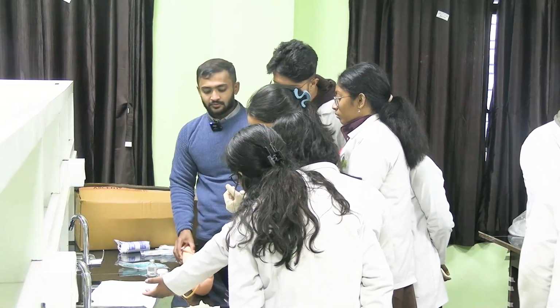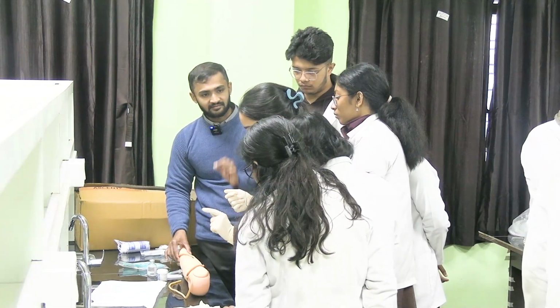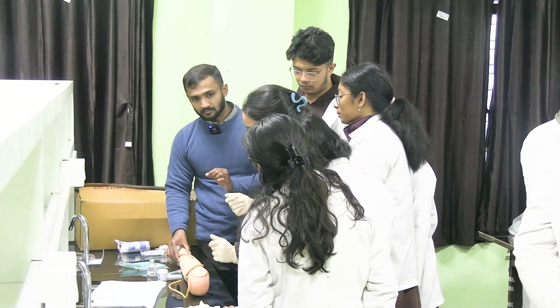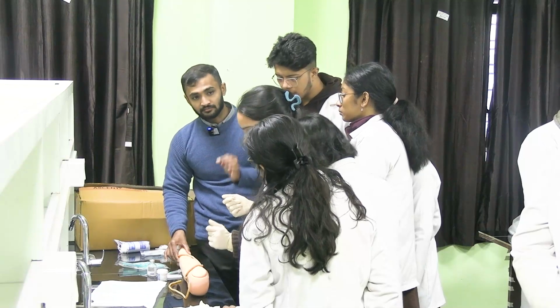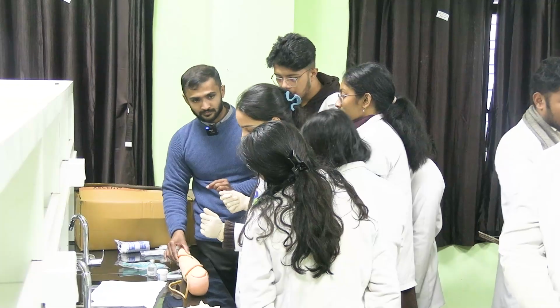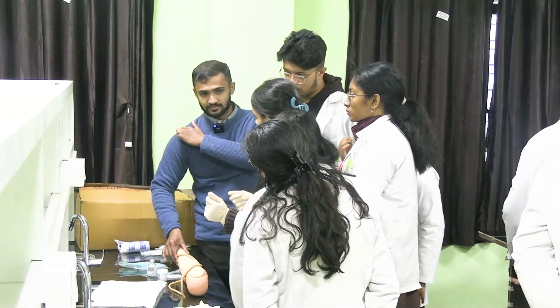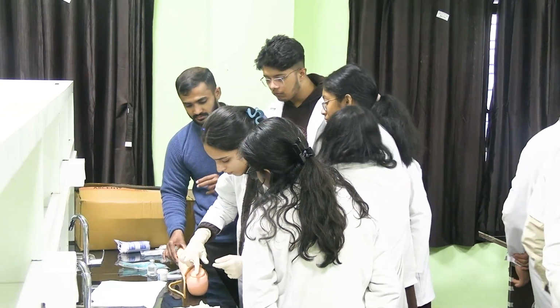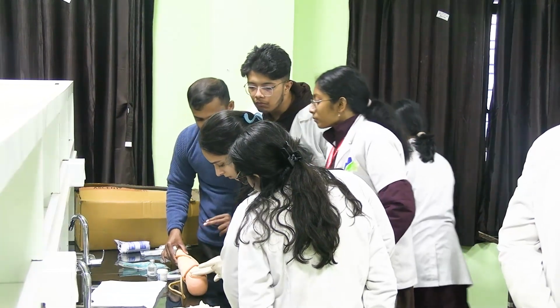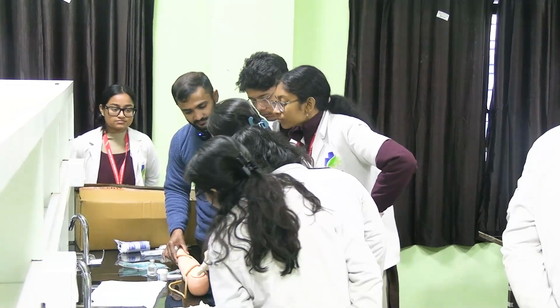So what is the next step? You have located the arm, you have located the muscle, then you have to locate the site. How to locate the site? No, that is the technique. But before the technique, you have to locate the site. Where will you be injecting? Where is the location in that muscle? The location is 1 inch or 2 to 3 fingers below the acromion process. This is the acromion process, 2 fingers below that, this area. So in this area you will be injecting the needle.